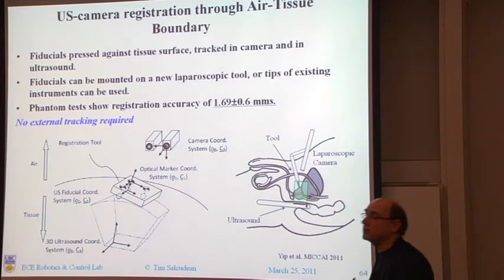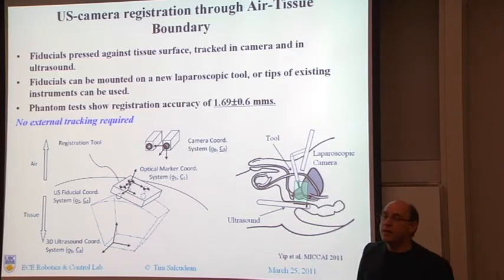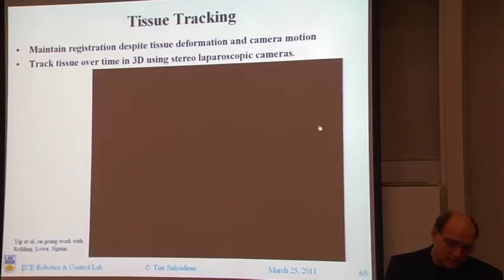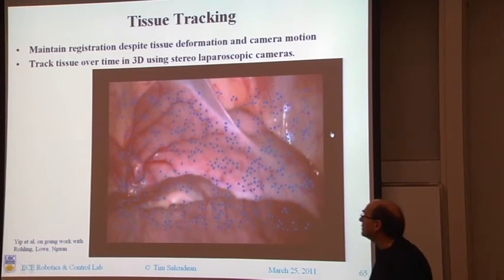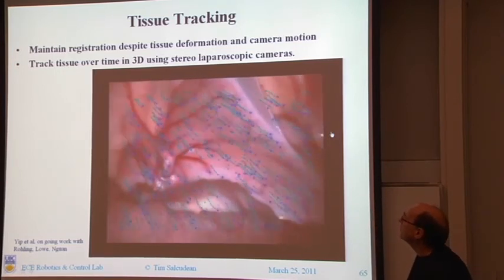And once you register something like the MR image, which may show lesions, you can actually track it intraoperatively by using a tracking system, which we now have working as part of Mike's thesis in collaboration with David Lowe. These are SIFT features that are tracked inside.